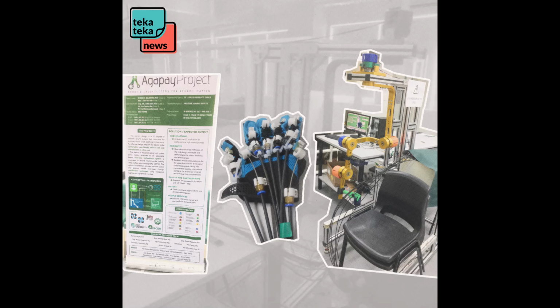Engineer Voltaire says the team had to painstakingly study and animate basic motions like raising your arm, touching your fingers, all the way to bringing a spoon or a bottle to your mouth and even putting on clothes. There are programmed movements for your elbows, wrists, and fingers too.